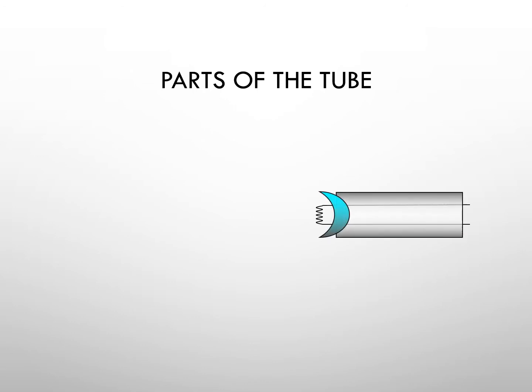Surrounding the cathode is a metal cup. This is called the focusing cup. This unit will focus the electron stream onto the surface of the target, creating the focal spot.